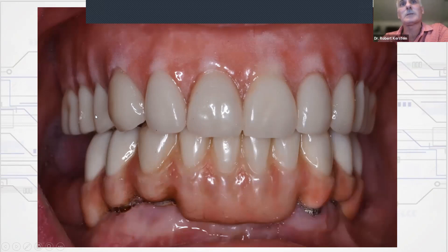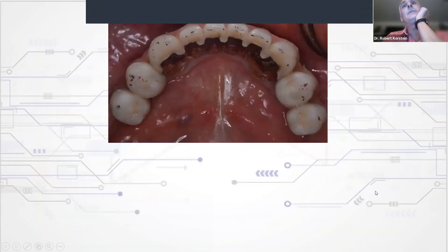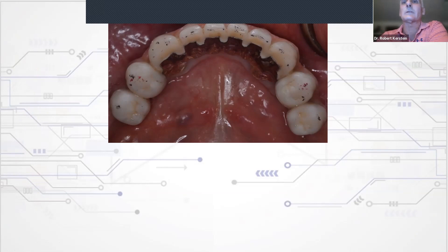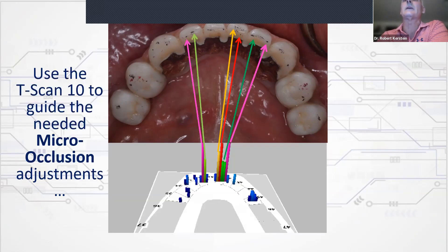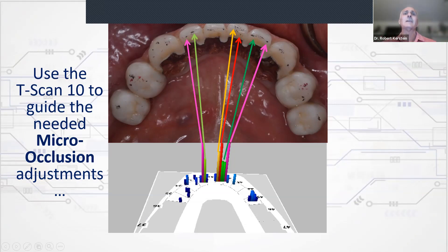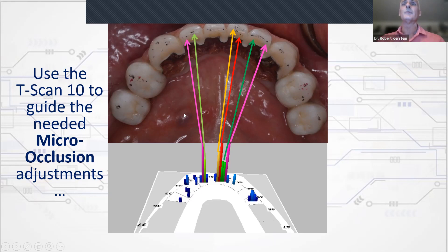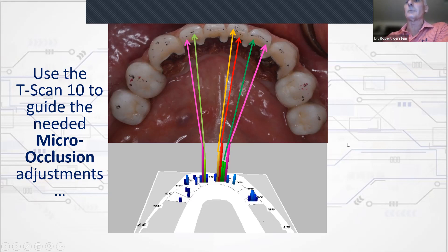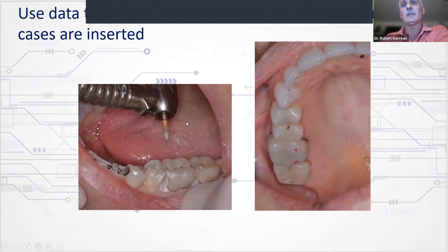Here's a perfect example: a maxillary overdenture against an implant hybrid on delivery day. There are paper marks spread all over the lower hybrid. The T-scan data makes it very clear we need to adjust the lower four front teeth, or the composite on that hybrid will likely crack. The T-scan 10 guides the needed micro-occlusion adjustments — controlling forces and improving patient adaptation. The macro occlusion is the way the case looks, but it doesn't guarantee the micro-occlusion will come out well.